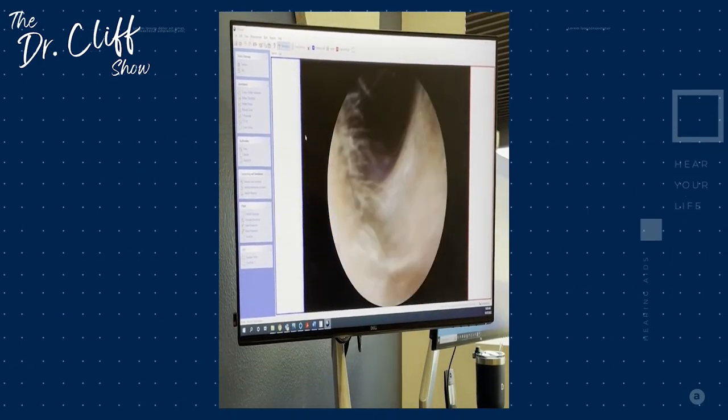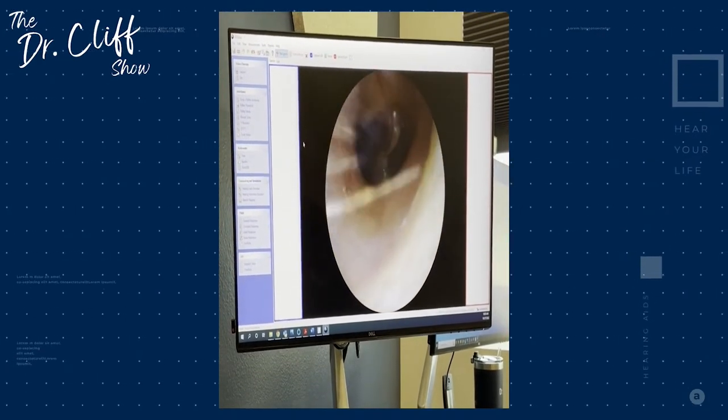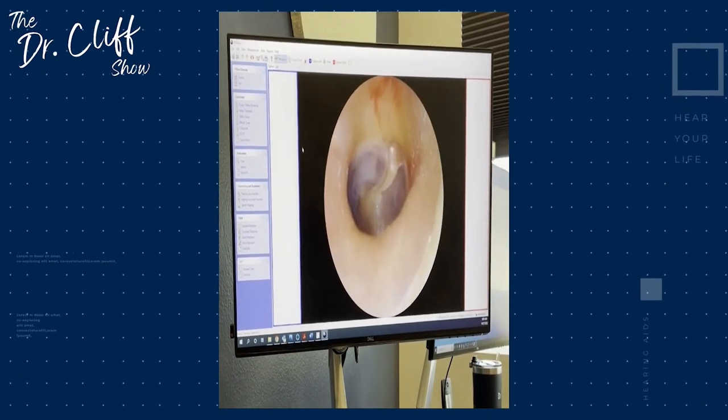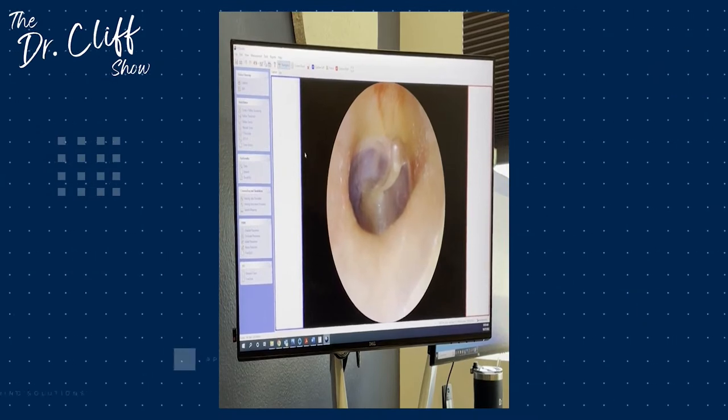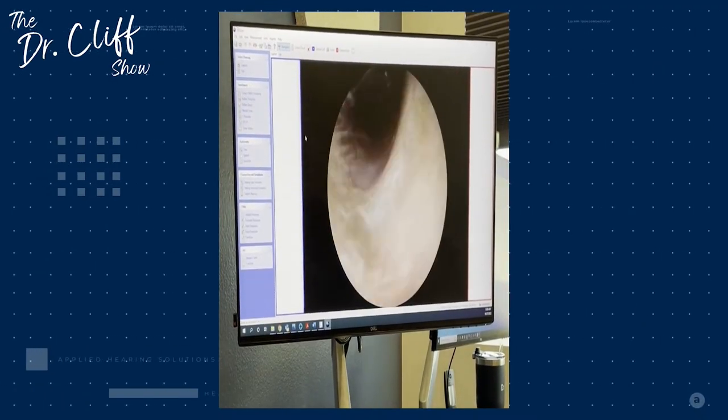And then one of the outside-of-the-box things that I like to do with the Otocam 300 is actually look at really small components of hearing aids. So, of course, we're an audiology clinic. We treat a lot of patients inside of our clinic with hearing aids. Sometimes they can't visually see something like a wax trap or a wax filter inside of their hearing aid that is blocked with earwax. Yeah. And so you can take that camera and shine it on the tip of their hearing aid and blow it up for them. And they're like, oh my gosh, I didn't realize how much wax was actually inside of that wax trap. Yeah, there's a ton of uses for it.